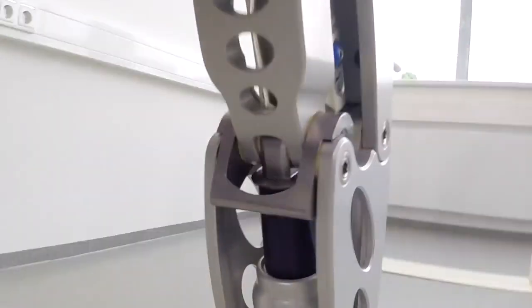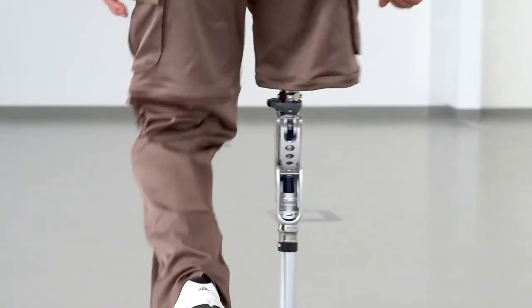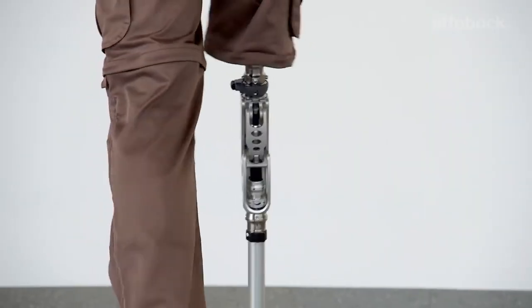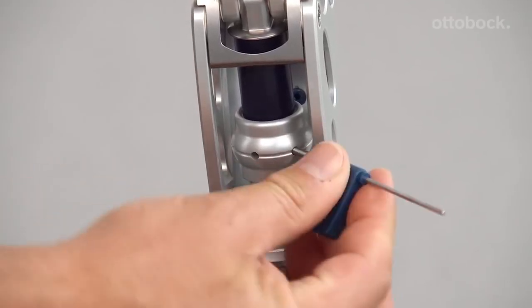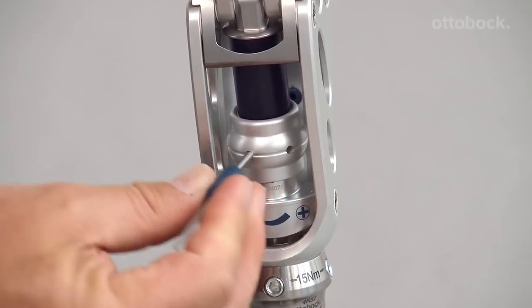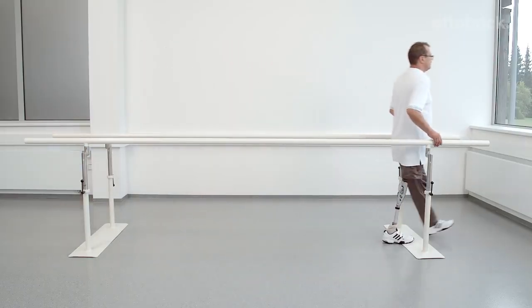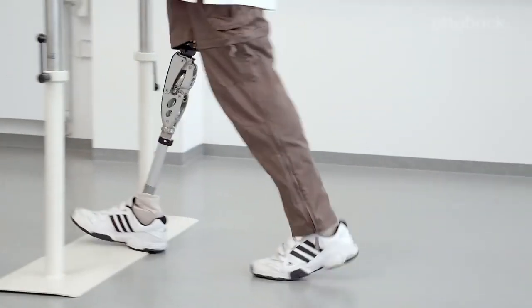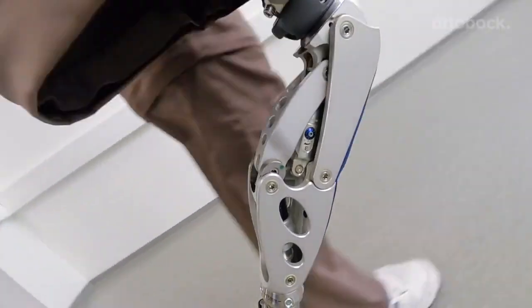At stance phase flexion, the blue rubber bumper is compressed, causing the pivoting mount to move up and generate resistance. The pivoting mount serves as a visual control for measuring the efficiency of the EBS unit. The knee flexion is controlled at heel strike by the adjustable elastomer element and allows a stance phase flexion of up to 15 degrees. At this point, the EBS unit has too much pretension, which leads to no stance phase flexion. The user cannot take advantage of the natural stance phase flexion.